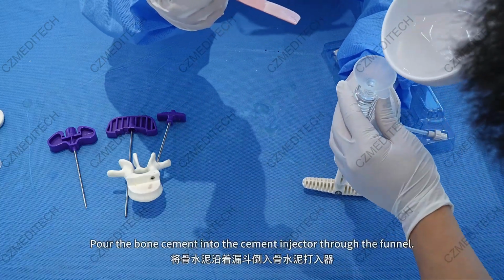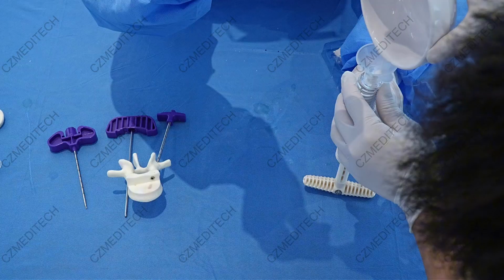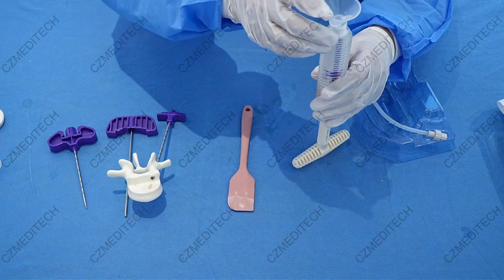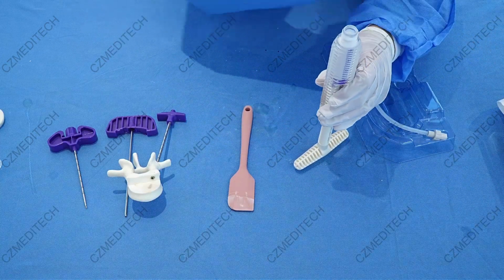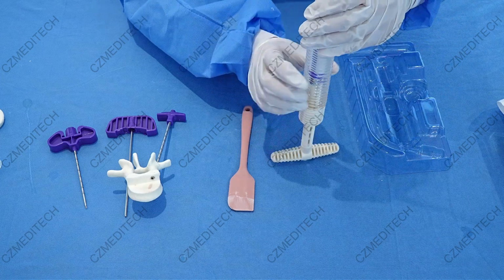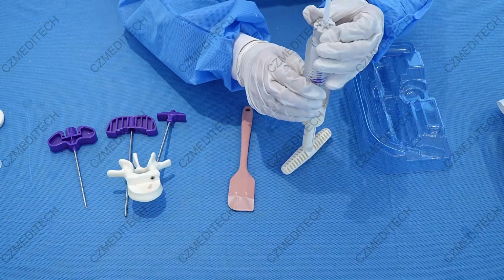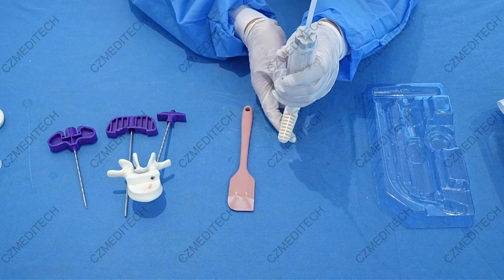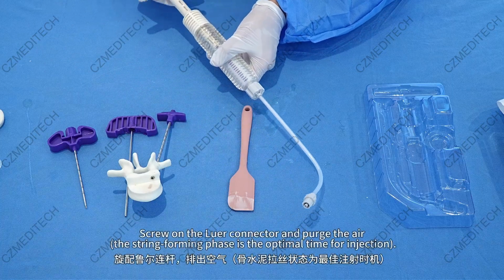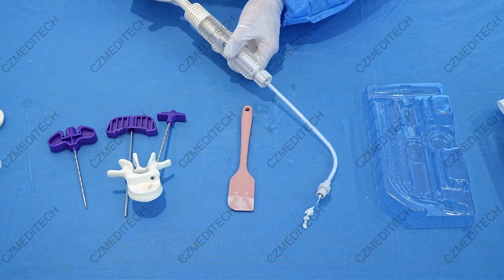Pour the bone cement into the cement injector through the funnel. Screw on the luer connector and purge the air. The string forming phase is the optimal time for injection.